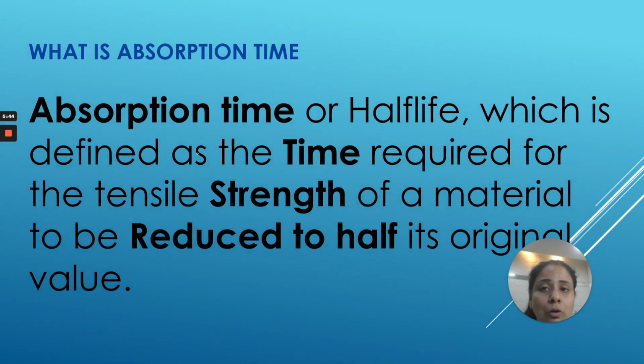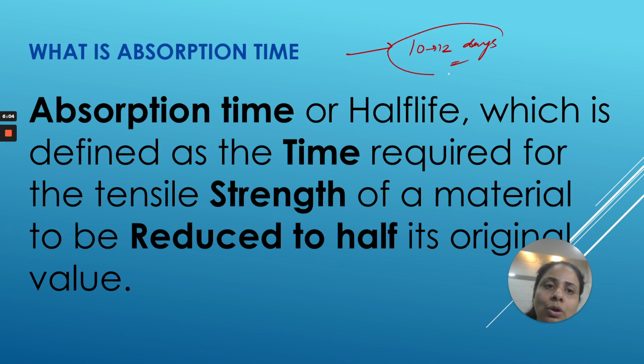And what is the absorption time? Absorption time, or half-life, is defined as the time required for the tensile strength of the material to be reduced to half. Suppose I am putting a suture material into the oral cavity and my healing time is around 10 to 12 days. I don't want any suture whose half-life is just 2 to 3 days, because within 2 to 3 days it will lose its tensile strength and be of no use to me.